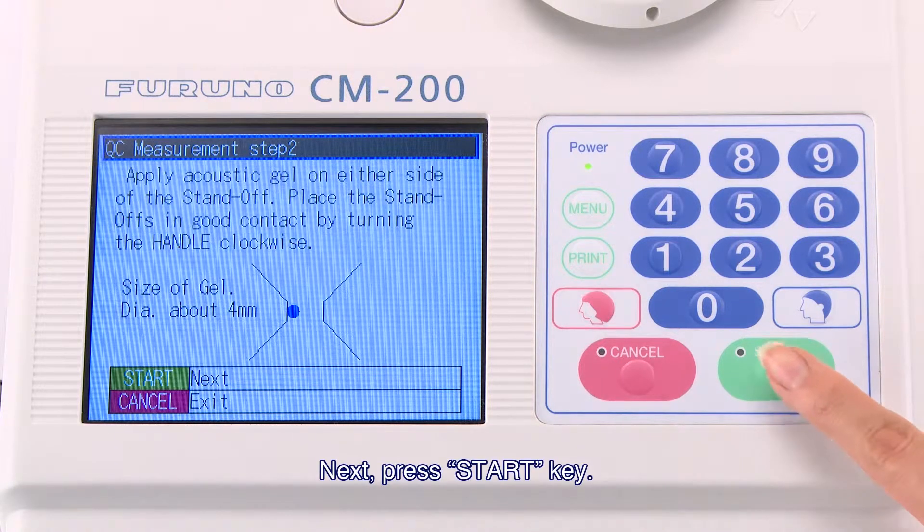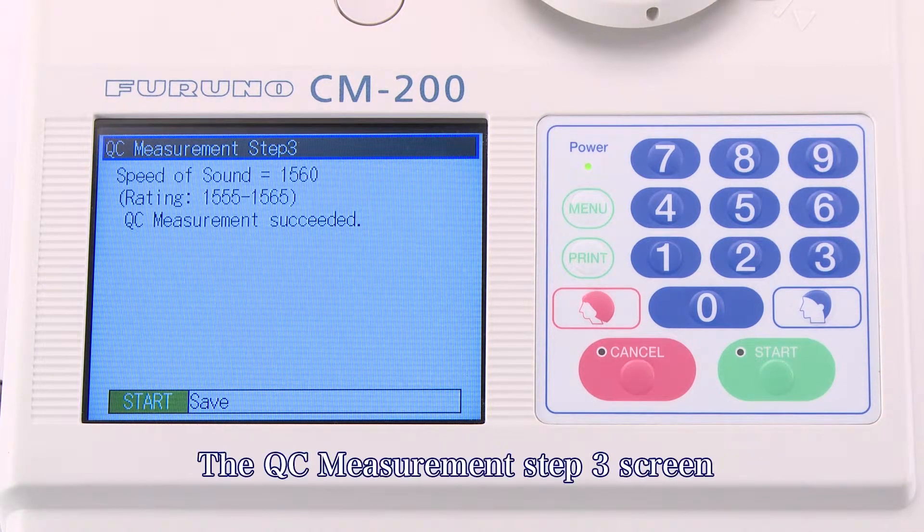Next, press the Start key. When the measurement is completed, the QC Measurement Step 3 screen is displayed.